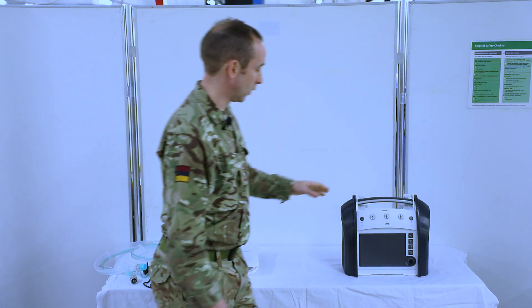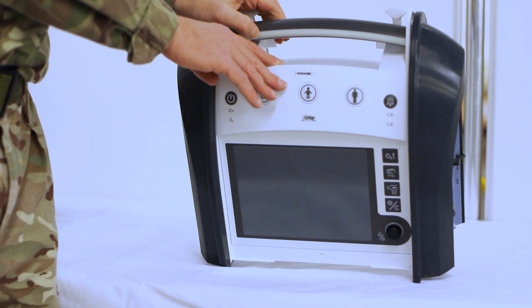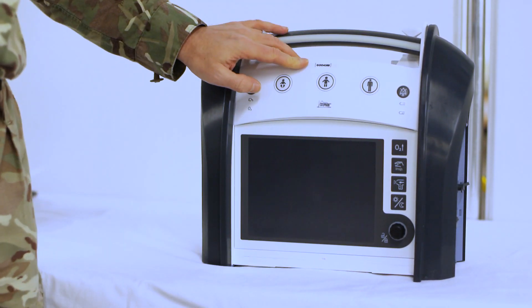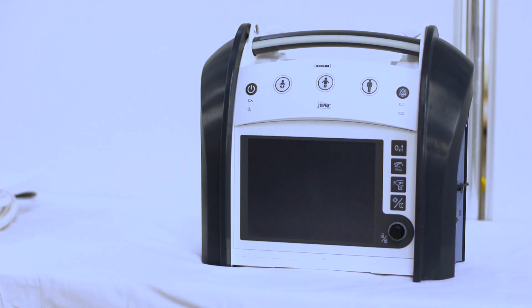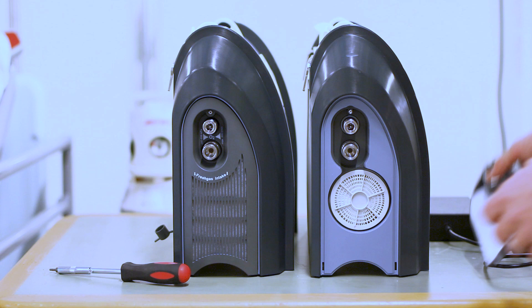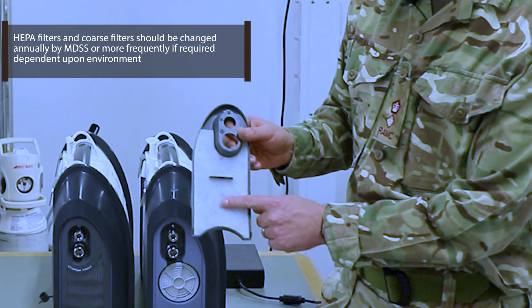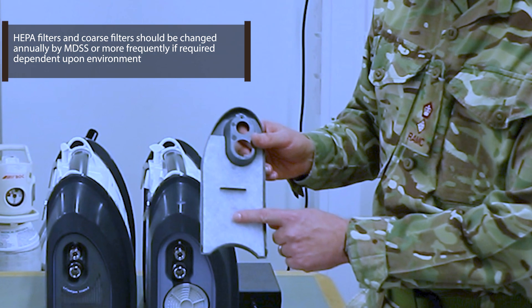We're then going to go closer to the machine and ensure that we have an MDSS in-date sticker. We're going to ensure that our asset number is correct and matches our documentation and also our ancillaries. We're then going to ensure that we have checked the HEPA filter and the coarse filter, and that that matches our documentation and that it's in date for servicing, i.e. it has been changed within the last year.